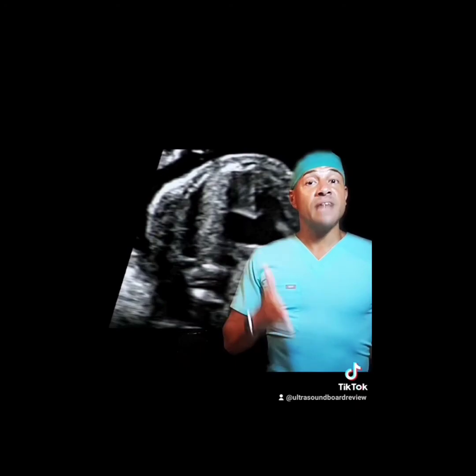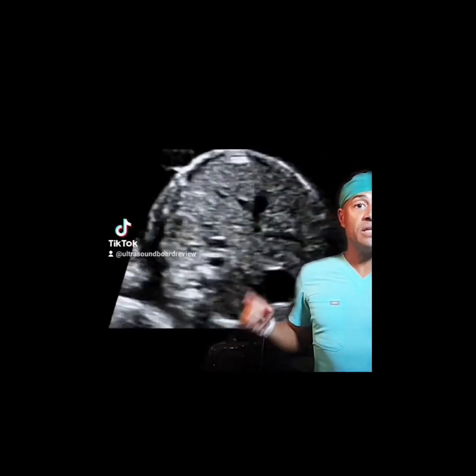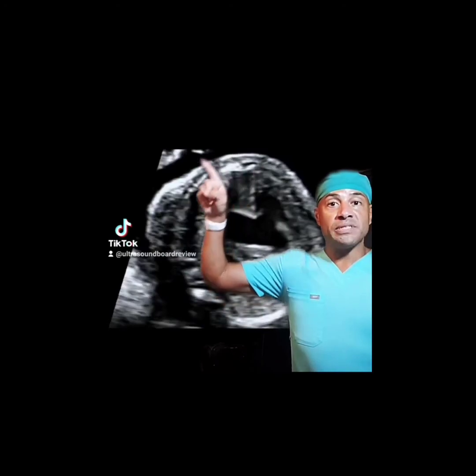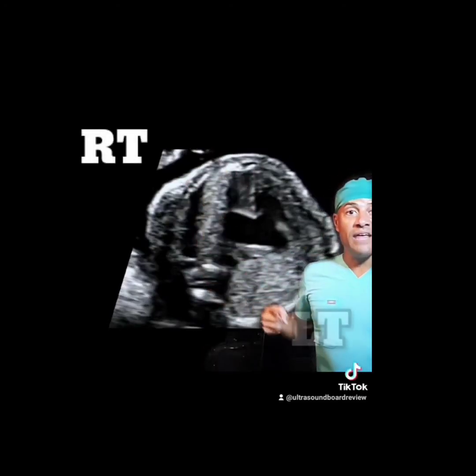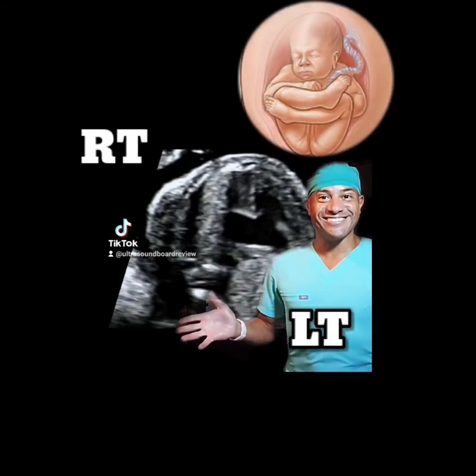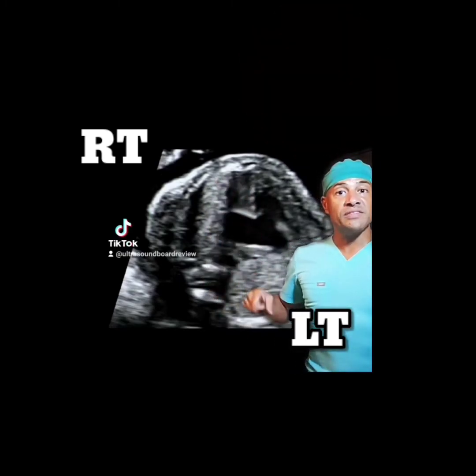Now that we determine the situs, let's determine the presentation. Since we know this isn't situs inversus, the stomach is going to be on the left side, but in this ultrasound, the apex is pointing towards the opposite side. So this has to be the right side. So if this is the right side, this is the left side, and this is the spine, that means this patient must be in the breech presentation. Since the majority of the heart is on the right side of the body and the stomach is on the left side, that means this patient also has dextrocardia.